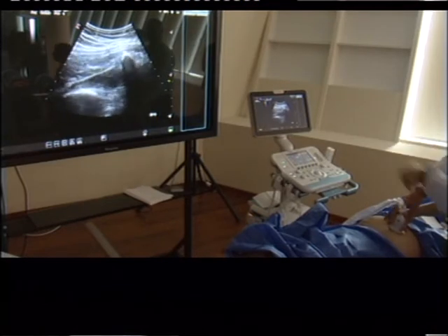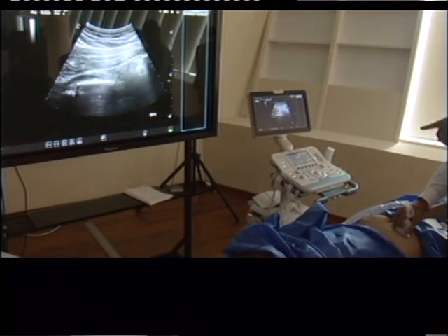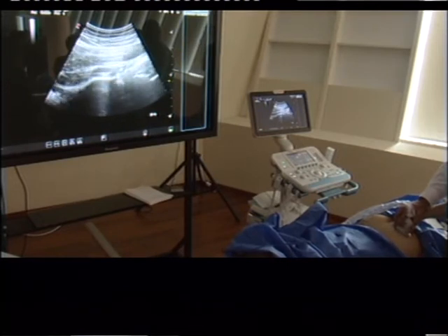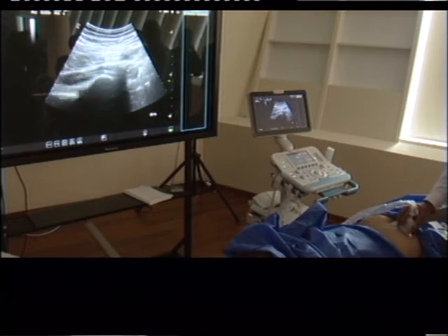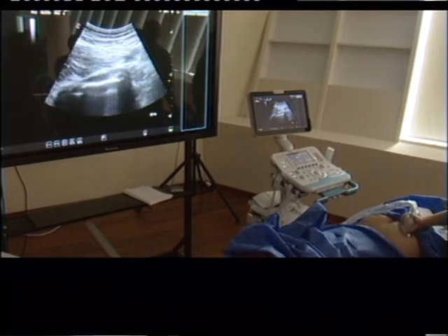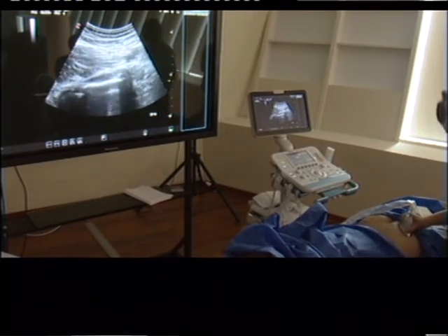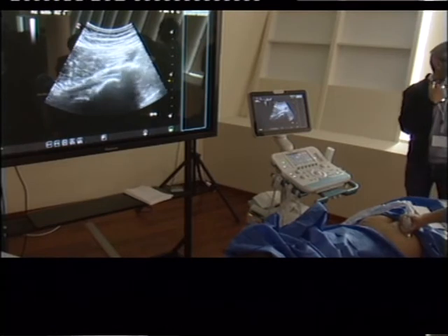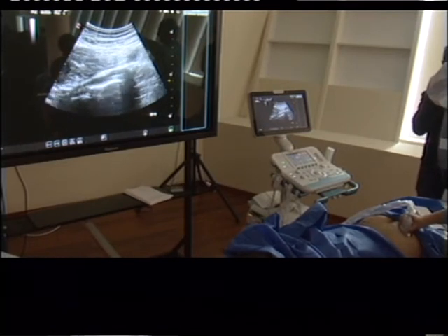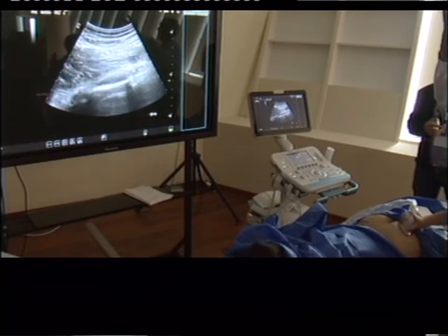Yeah, so that's piriformis. Piriformis, and underneath you see there's also the complex. Flat, pudendal, and now okay. Waterfall. Sciatic nerve, over the top. Now yeah. So if you look at me, piriformis. Ah, the waterfall, I understand. Yes, the waterfall.